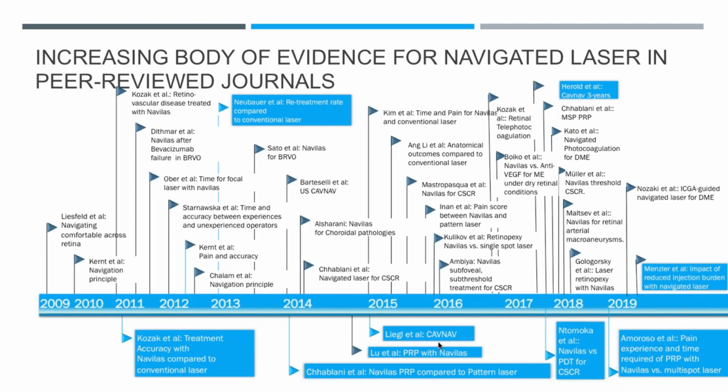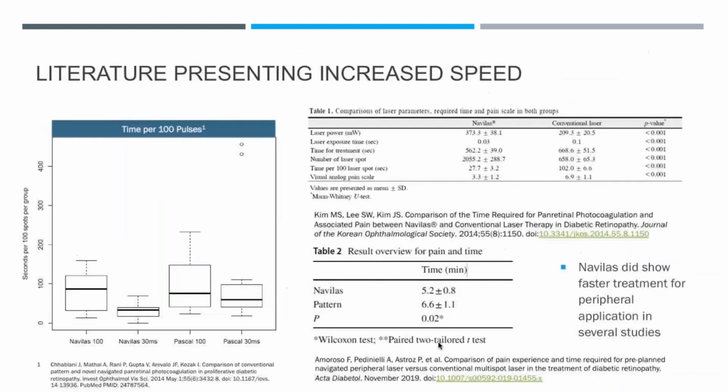And as we can see, there are too many of these applications by authors from all around the globe, pointing to the increased popularity of using navigation in retinal treatments. Let's go over some literature pointing to the practicality of application of navigated laser.